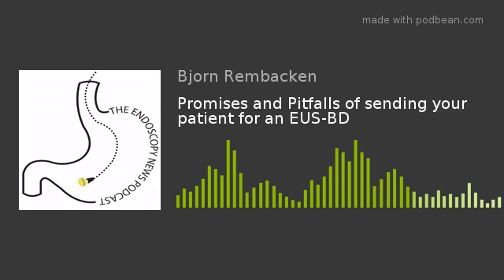We've had one patient who had biliary stone disease causing acute pancreatitis, which has also caused a large walled-off necrotic collection next to the excluded stomach. So that patient had an ERCP from the excluded stomach and also an EUS-guided cystgastrostomy from the excluded stomach as well.